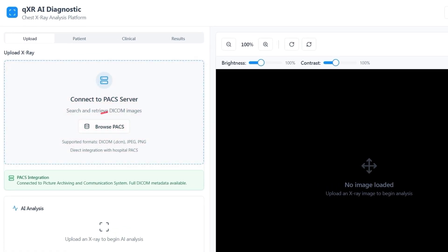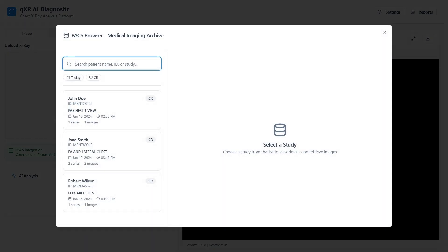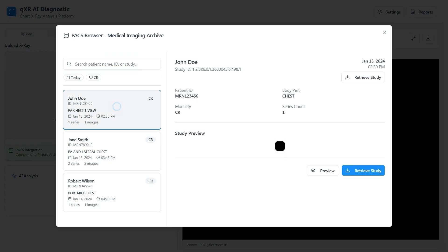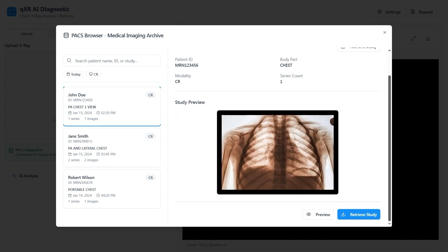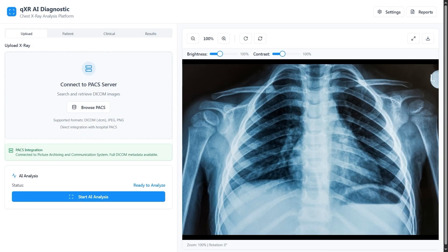First, clinicians need an image to work with. They can upload it directly or browse through an integrated picture archiving and communication system. When a patient is selected, the clinician clicks 'Retrieve Study' and the platform pulls the associated image along with the patient's EHR profile.